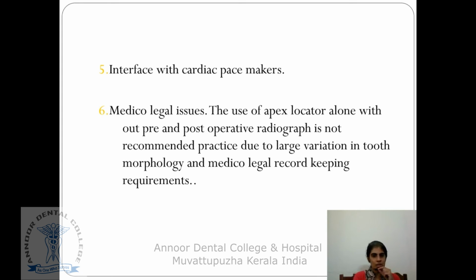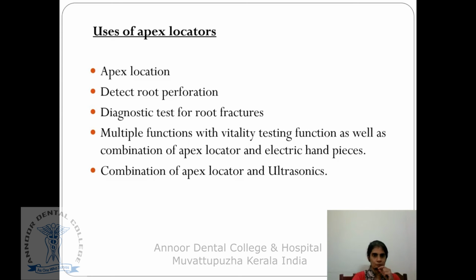Next is the medicolegal issue. You cannot rely on an apex locator completely, because when you take a radiograph and you have a pre- and a post-op radiograph, in case of medicolegal cases, you will have a record, whereas if it is an apex locator, you cannot have a record. So these are the common problems which we face with apex locators.